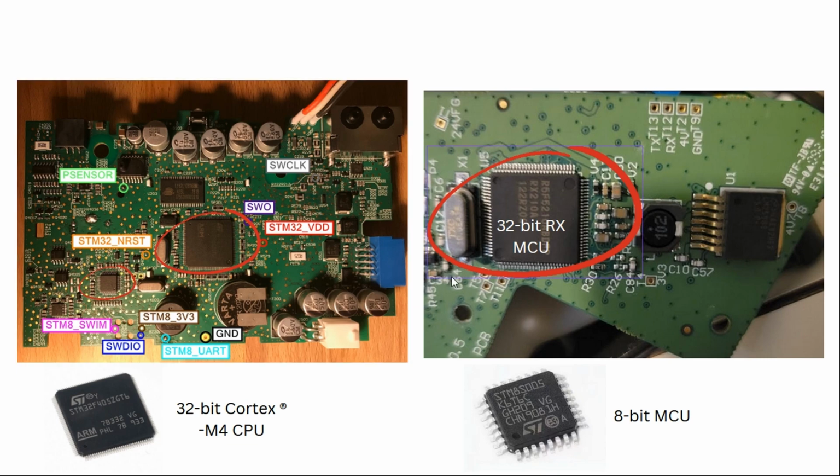On that smaller auxiliary board, we have another microcontroller, this 32-bit RX MCU, which interacts with the modem chip, which does a lot of the teleservices for sending data to both your doctor and the ResMed app. So this, in a way, also acts as an auxiliary microcontroller, offloading a lot of that heavy work from the main microcontroller unit and just sending the data over to it instead.